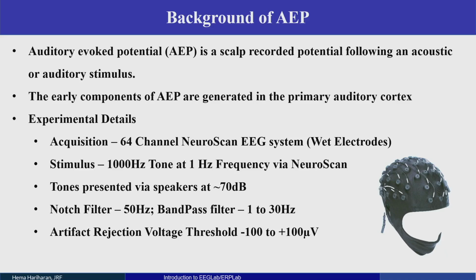Here we are using an experiment. In this experiment which I have been working on, we used the Neuroscan 64 channel EEG system, wherein the cap, as I have shown here, has electrodes placed over the head. These points over here are the electrodes which make contact with the scalp of the head, and that is how the EEG is acquired.